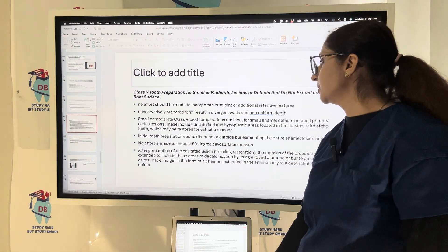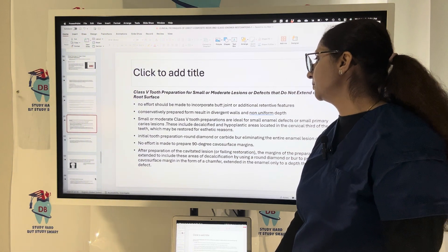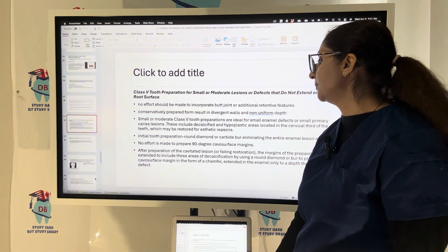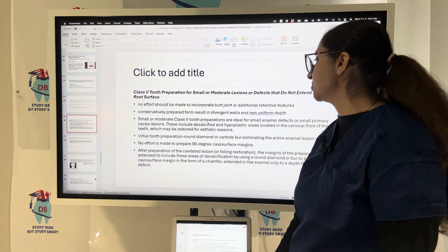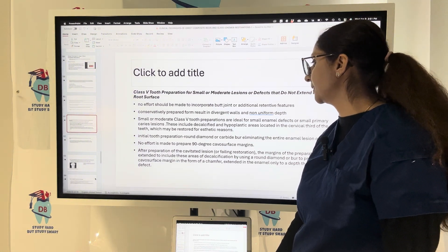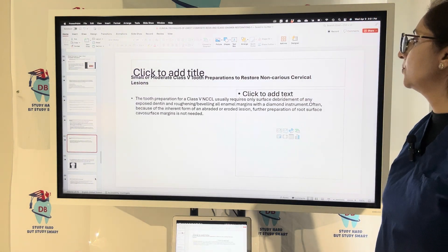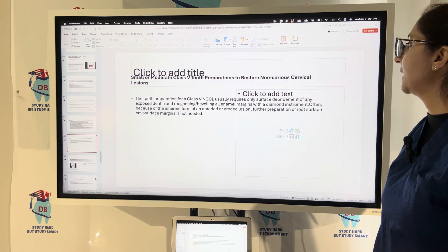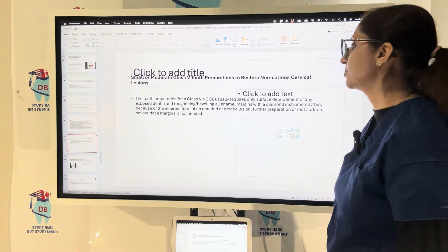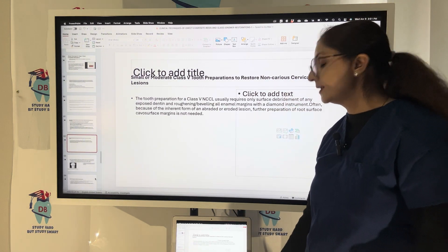Initial preparation uses a round diamond or carbide bur to eliminate the entire enamel lesion or defect; no effort is made to prepare 90-degree cavosurface margins. After preparation of a cavitated lesion, the margin is extended to include the area of decalcification. A round diamond bur is used to prepare the cavosurface margin in the form of a chamfer. For abraded or eroded non-carious cervical lesions, only surface debridement and beveling/roughening of the enamel margin with a diamond instrument is required.